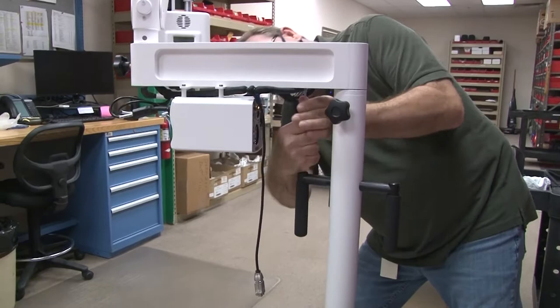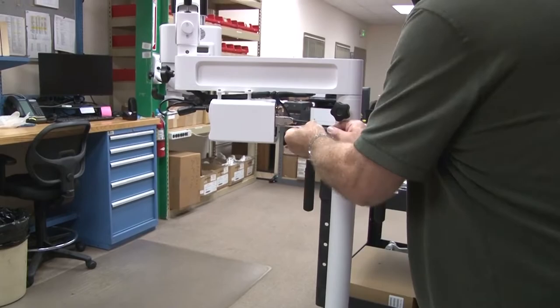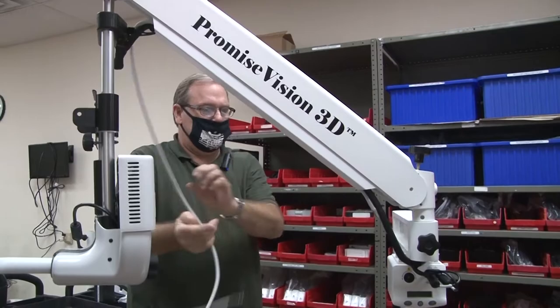Plug this into the back with two screws to tighten. You've got your light guide — listen to that port.